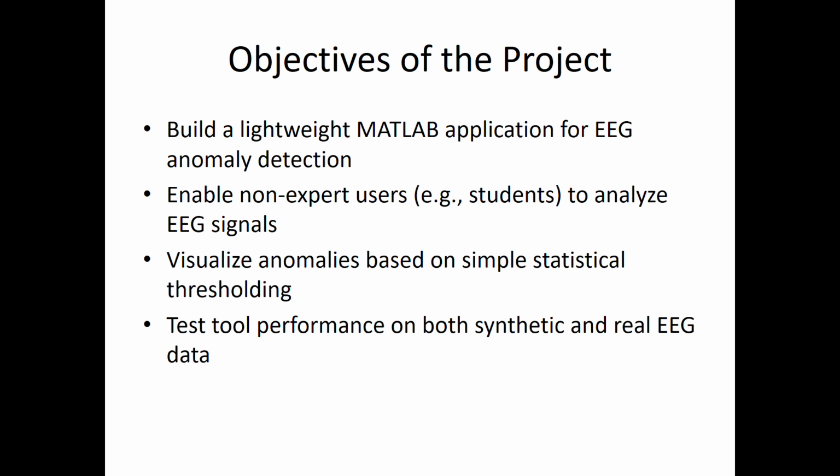The main objectives of the project were to build the application using only basic MATLAB tools, no additional toolboxes, to ensure the tool can analyze real EEG data, to allow user interaction through adjustable parameters like threshold sensitivity, and to validate the tool using both simulated and real-world EEG datasets.